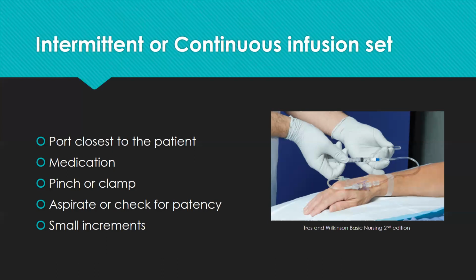You will also see that sometimes if you're unsure of if there's compatibility or anything, that people may use the SMS, the saline medication saline, even with a running line. That's not necessarily wrong. It just is extra precautious. So you would have a running line, you'd flush it with saline, and then you would give the medication and then flush the line behind it. So that's not wrong either. So that's all that we have for this PowerPoint slide.